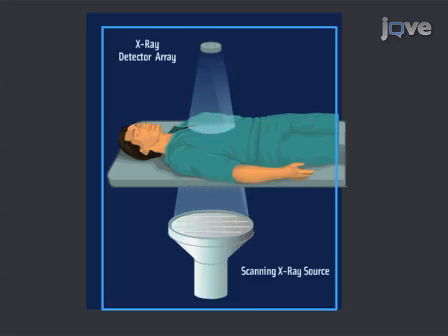To acquire a single imaging frame, we acquire thousands of detector images, with each detector image only viewing a small portion of the object. Inverse geometry imaging leads to a significant reduction of scatter in the images. This allows us to acquire these images at much lower dose.